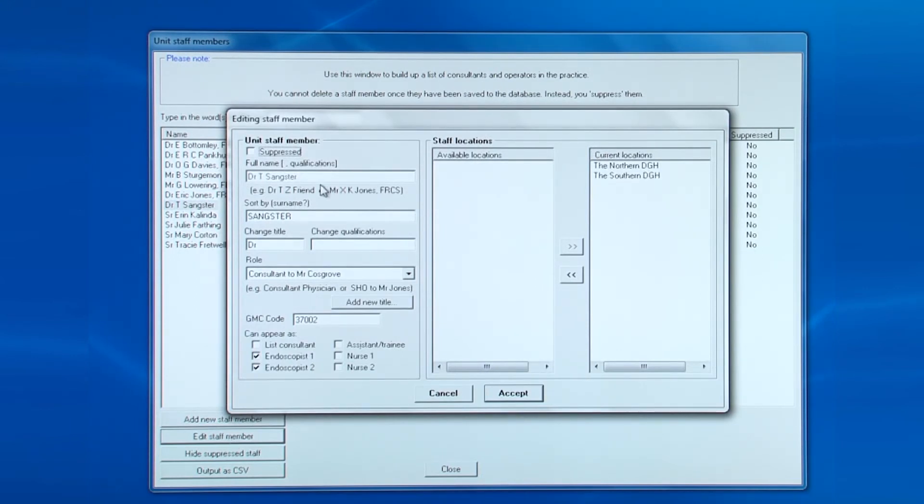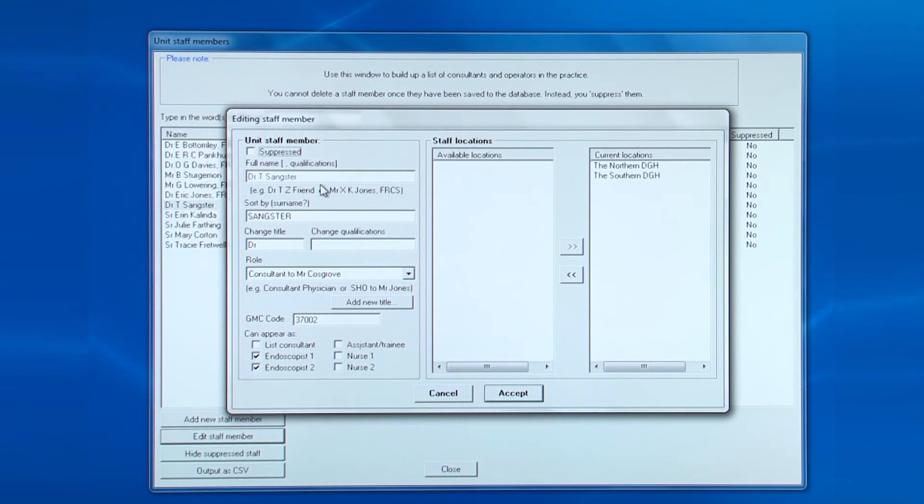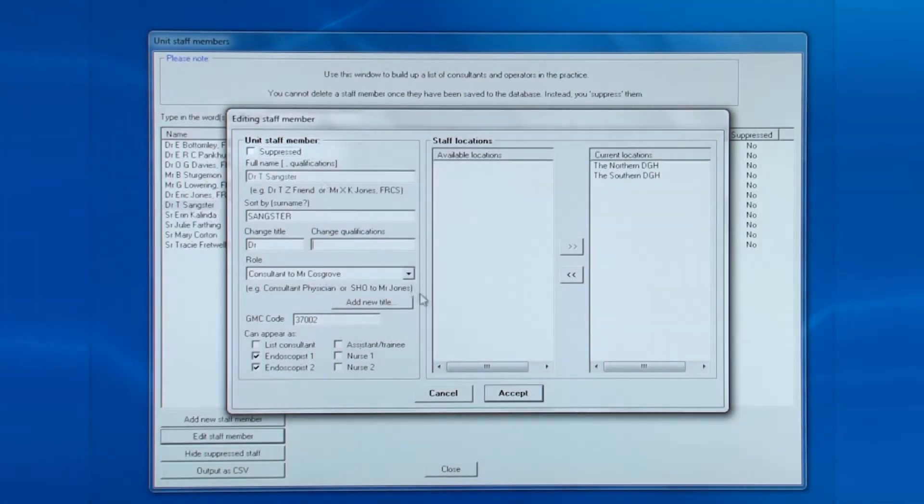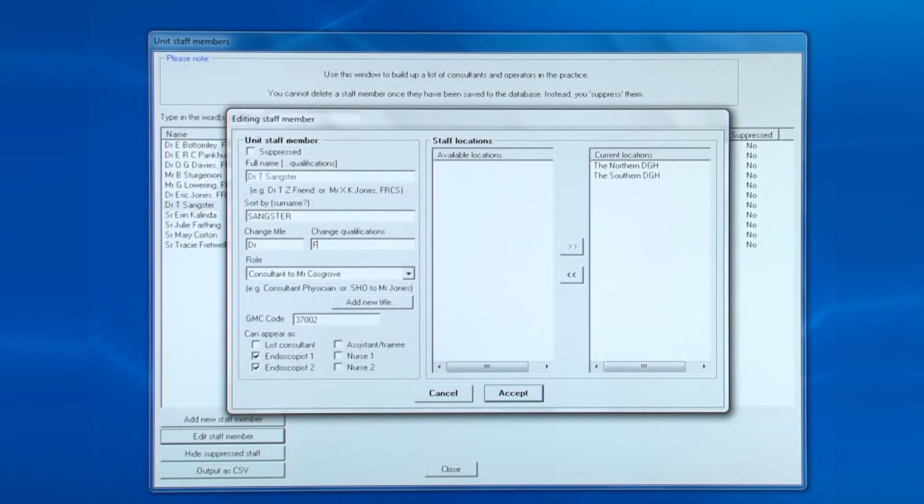Note, you cannot change his name. If a mistake had been made, then all you can do is suppress this staff member from appearing and re-enter him.